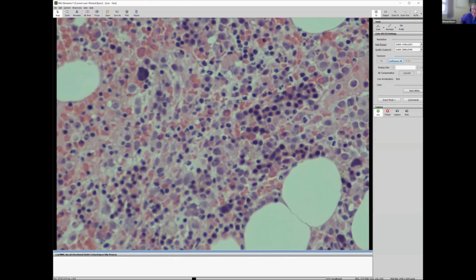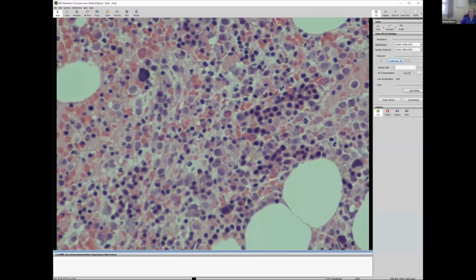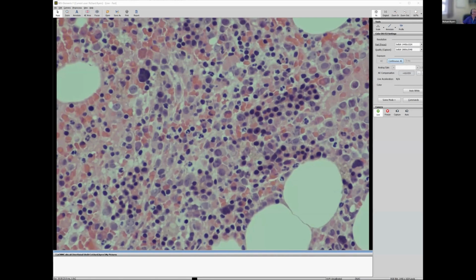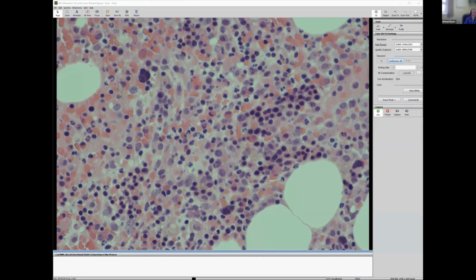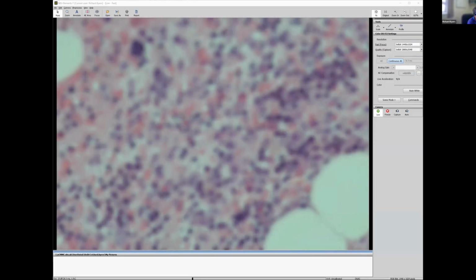So, the question was whether this amounts to chronic myeloid leukemia. It's interesting because the white cell count isn't particularly high. It's only 7.3. Otherwise, I think this does fulfill the criteria for chronic myeloid leukemia. We've got increased megas, massively increased myelopoiesis with maturation, but also left shift. Some preserved erythropoiesis, usually a bit lower than in this case, but they've often got marked megakaryocytic expansion and hyperplasia and dysplasia, and also increased eosinophilia. So morphologically, this is consistent with a chronic myeloid leukemia.